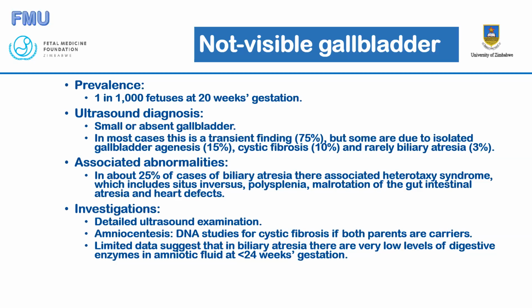So this is why we want everyone to be conversant with fetal anatomy, because the review cases normally are treated differently from first timers. So if you are seeing someone for the very first time, effort should be made to screen for all the major defects that we are discussing in our defects series. Because the first person to see the patient is probably the one who is going to do the most detailed scan on that patient, except those probably who have been referred to special screening for one reason or another.